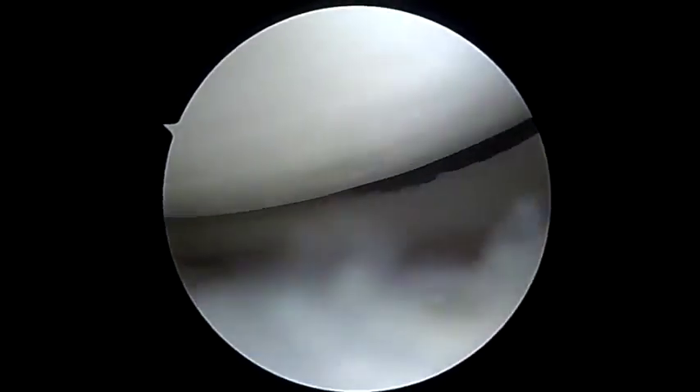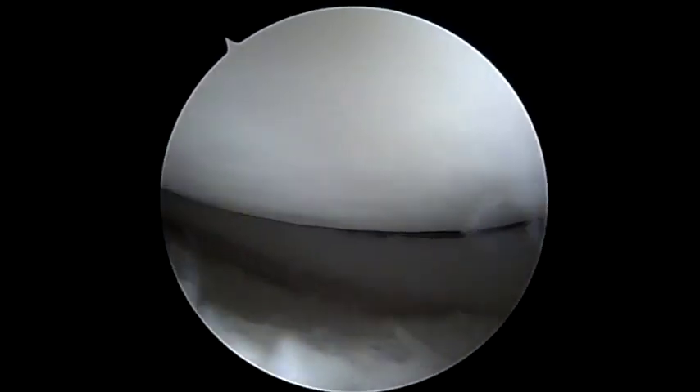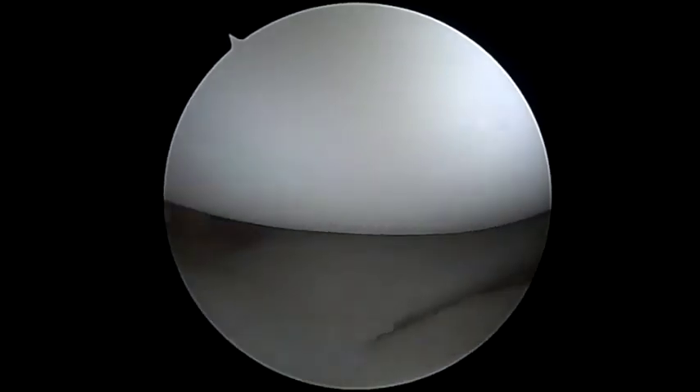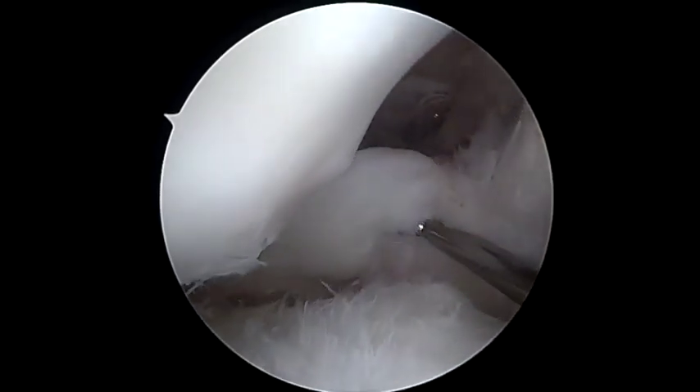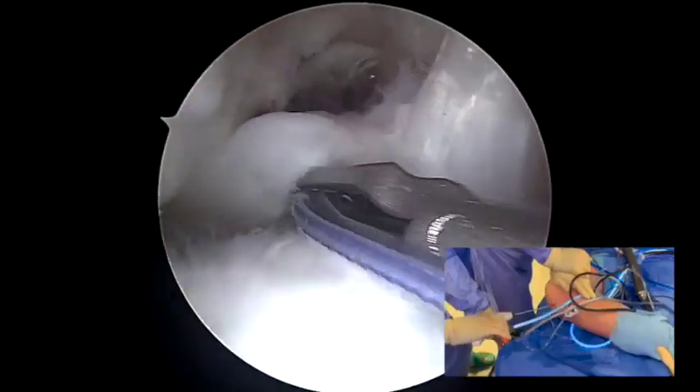With the leg in a figure of 4 position, the lateral compartment is inspected and a type 2 complete tear of the posterior root of the lateral meniscus was observed. The stability of the meniscus was checked and the complete liftoff of the meniscal root from the tibial plateau can be seen. The footprint of the posterior horn is refreshed and debrided by the arthroscopic shaver to promote healing.